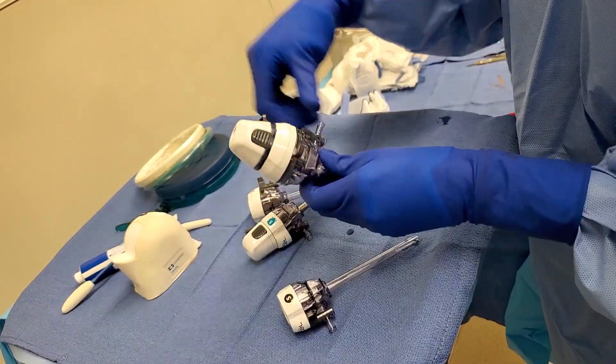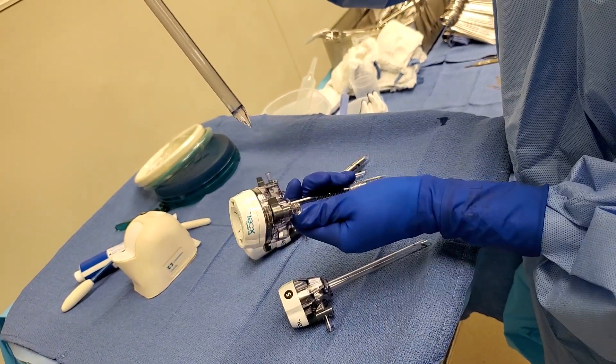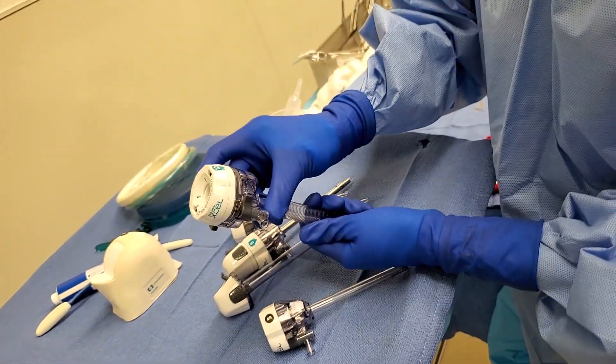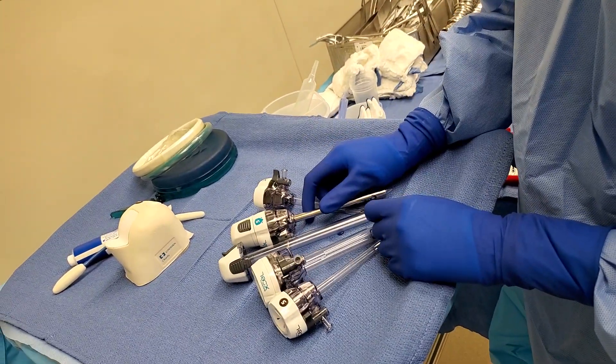To take it out, you just pinch this and then you're done. And that is how you use the laparoscopic trocars. Oh my god, I forgot!